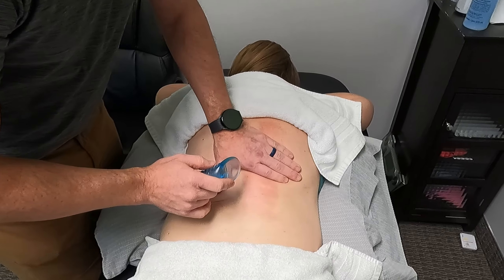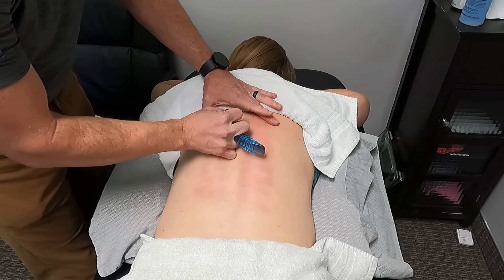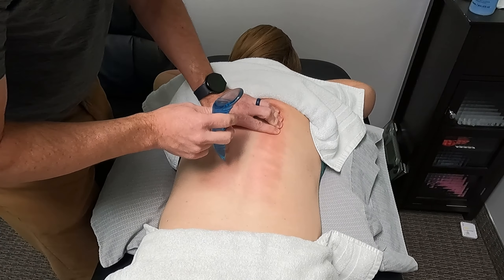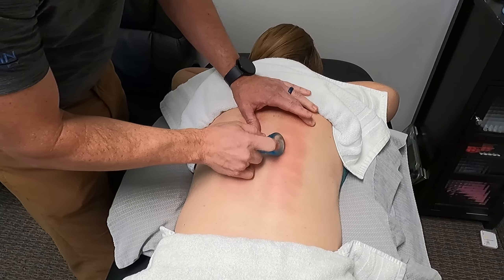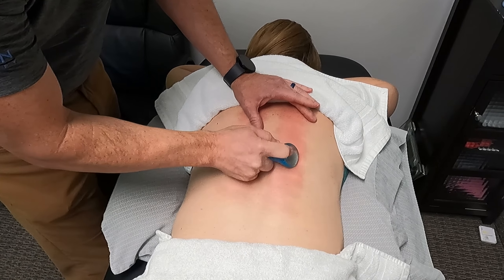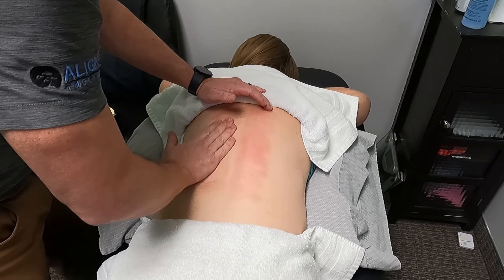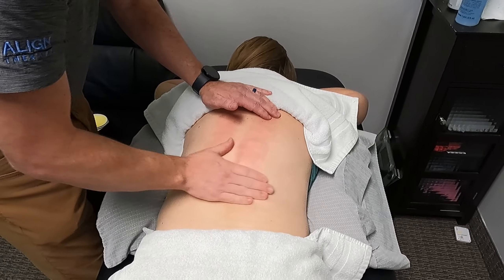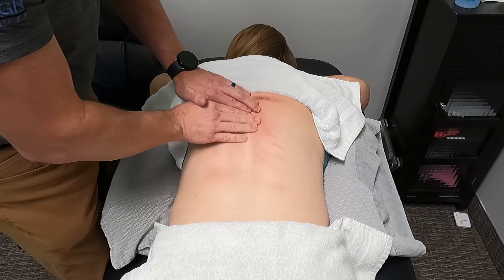After I do some ASTYM on somebody, I'll still hit a few different spots where I feel things are tight. Dionne gets really tight through her mid to lower thoracic spine and up by the shoulder blade. So we'll do a little manual therapy, a little soft tissue work there. Anywhere I really want to focus on, I can dial in and work right on those tissues. Then you relax the muscles a little bit more and get into some soft tissue work like regular massage.